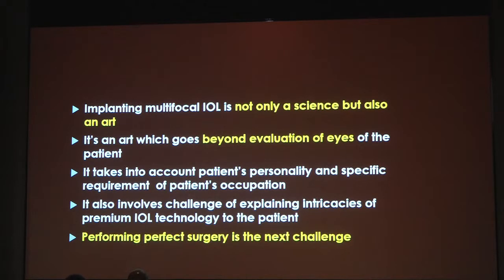It also involves the challenge of explaining the intricacies of premium IOL technology, because if you say that I'm going to put a multifocal IOL, patients' expectations will reach sky high. And if those expectations are not met, then the patient will be an unhappy patient. The patient may get 6x6 and N6 vision unaided, but patient satisfaction will not be there.